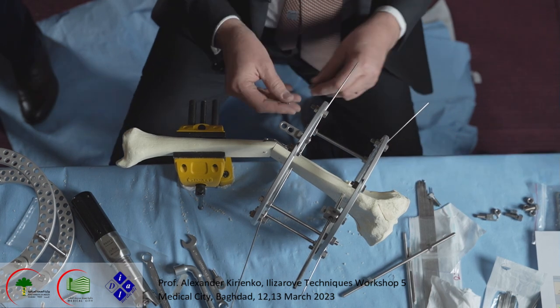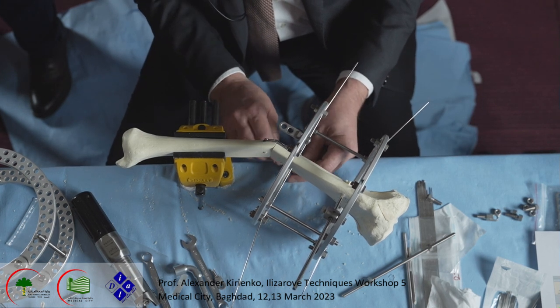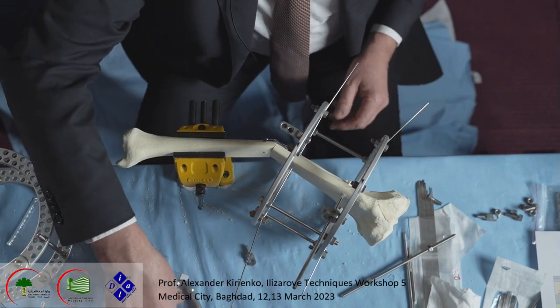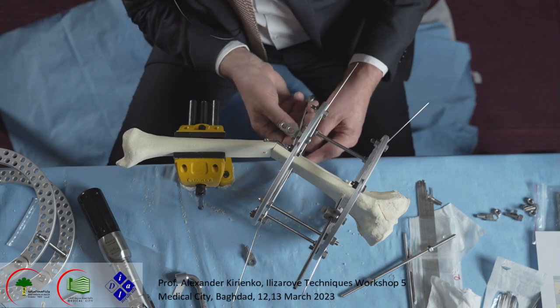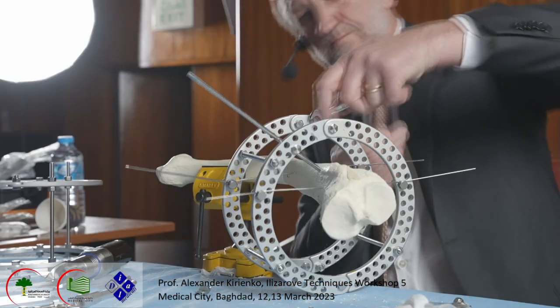Another hinge, two hole post male, I put here, symmetrically. Okay. And they should overlap one another on the same plane, same length.